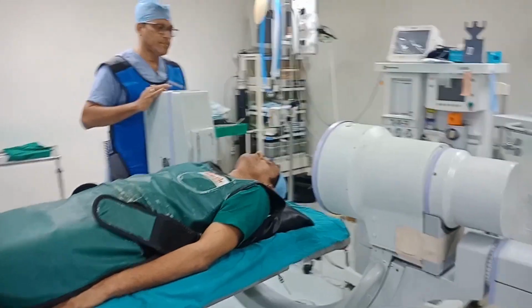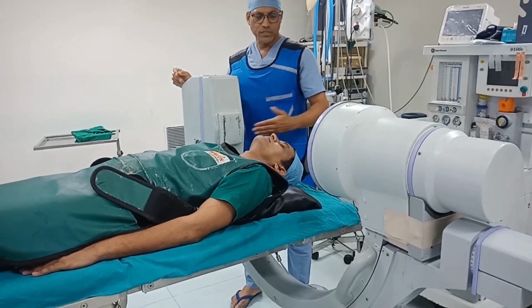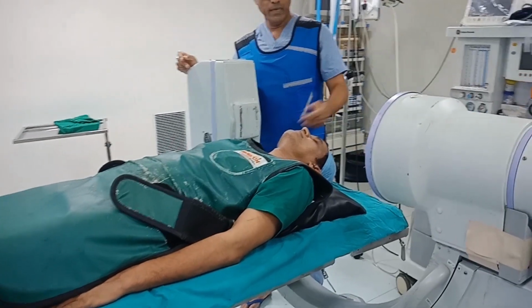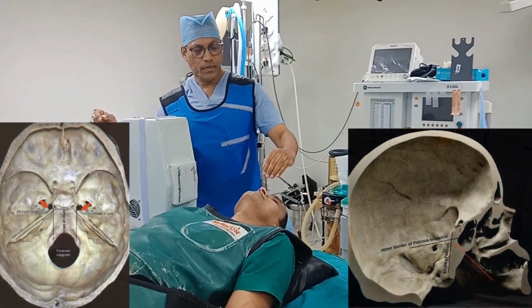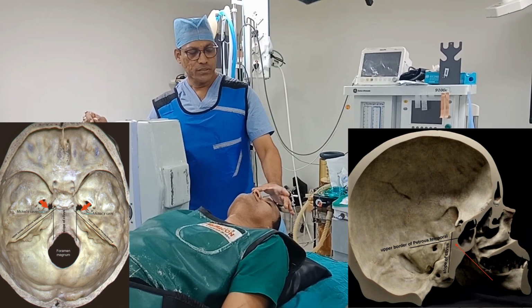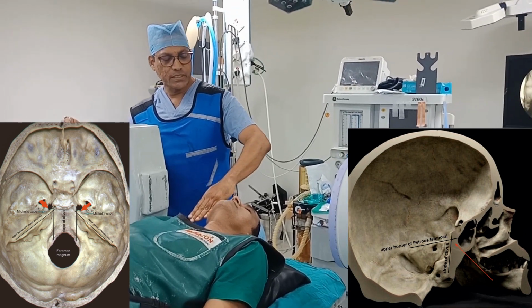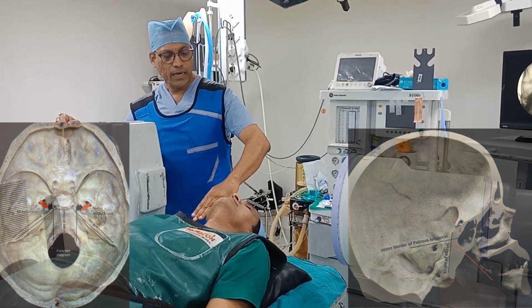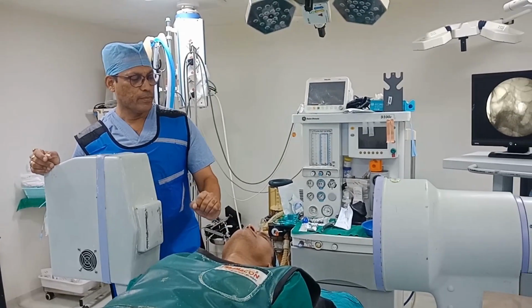We have to take the image intensifier in such a way that all the structures superimpose, mainly both the mandible, both maxilla, the slope of the clivus, and the petrous. Then I will see the base of the skull perfectly, so that I can assess the depth of the needle perfectly inside the foramen ovale.